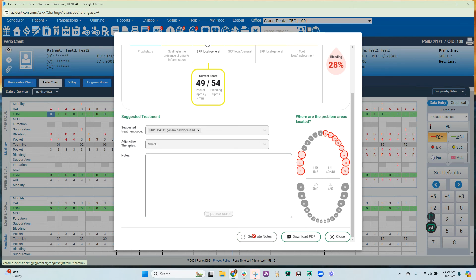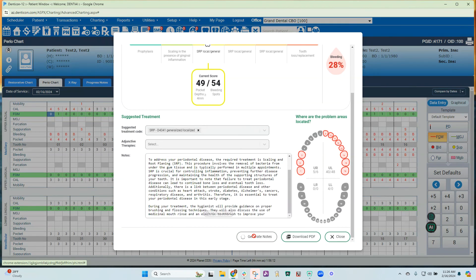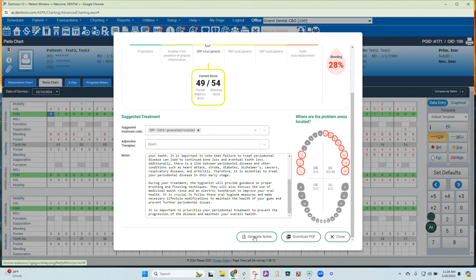Once you click that, it will fill in. When that has completed, you can download this as a PDF. Once you download it as a PDF, you can save it to your patient's chart, print it out for your patient, email it to your patient, or use it as an insurance narrative. And this is how to use VOICE within Denticon. Thank you, everyone.